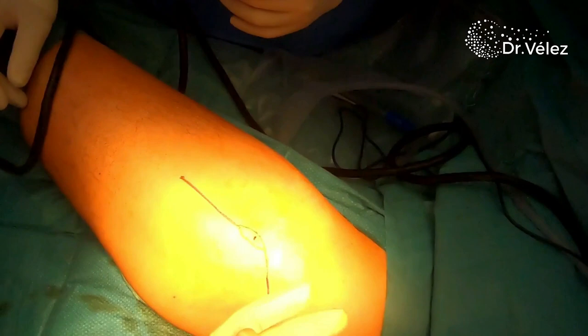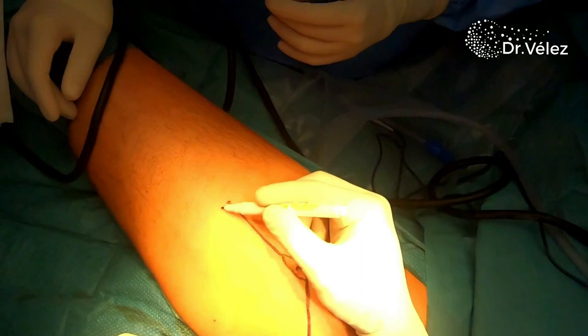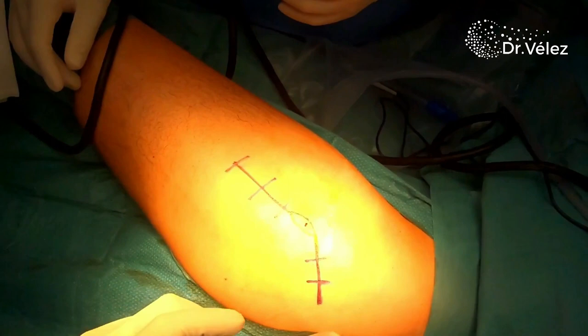So the patient is in a lateral decubitus position, and we are planning for a posterolateral hip approach. We identify the previous biopsy site, which is in line with our incision.